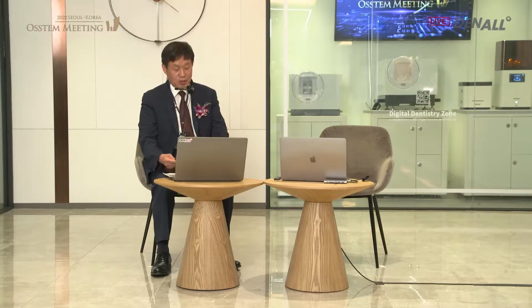I can see that live surgery occurred very nicely and successfully. Dr. Chung placed the 6 implants in the upper very calmly and 4 in the lower. Successful surgery has been done. And Dr. Chung is going to come to the hall and we're going to have Q&A. I think a lot of questions are being raised in the chat.